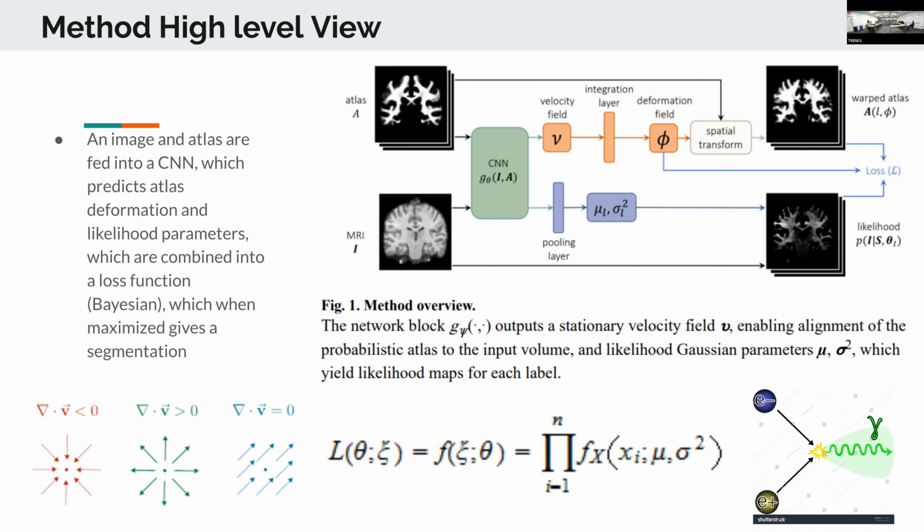That's very interesting. Let's take advantage of what we know. Instead of just segmenting any random image, it says we already know it will be this. We just don't know where those regions will be located, and their topologist friends, what do they call this transformation? Homeomorphic. Like the regions can move, but when they move, other regions around them move too. So let's take advantage of that and just stretch or deform what we have. But that's a totally different picture than I had walking into this. It's not the way I thought it would be done.